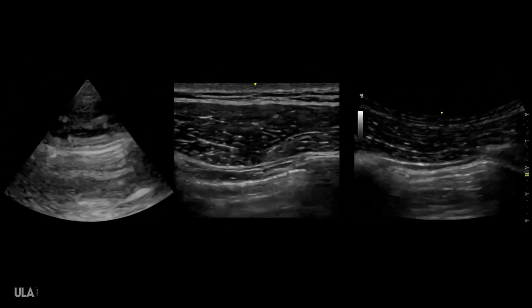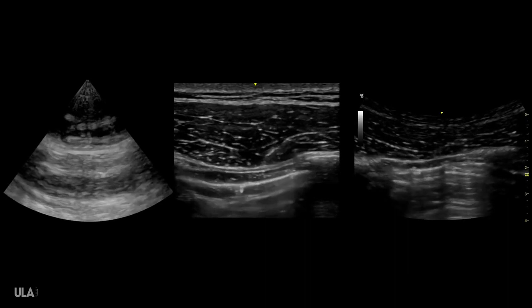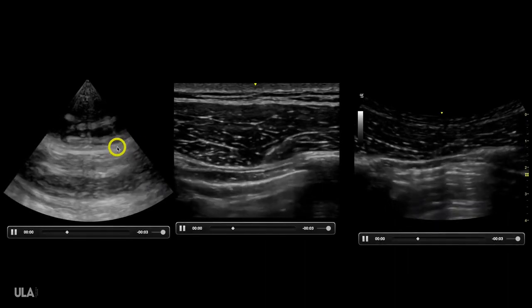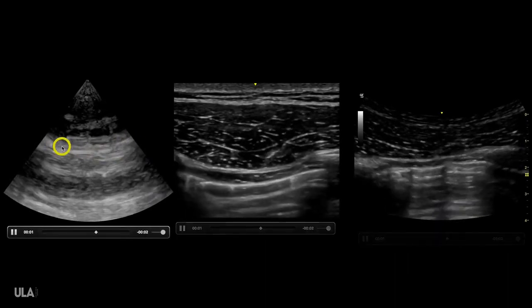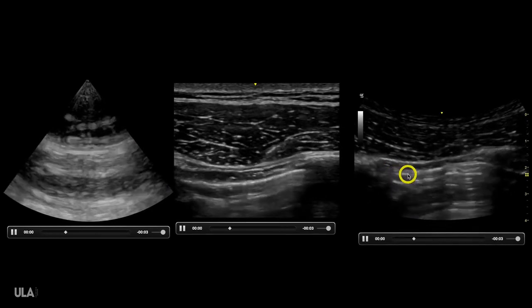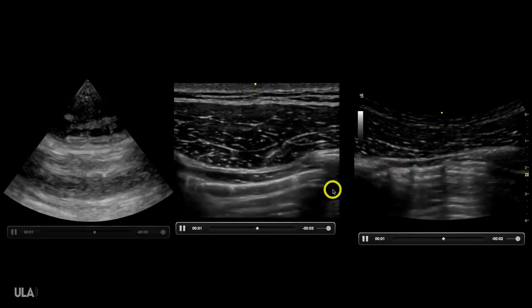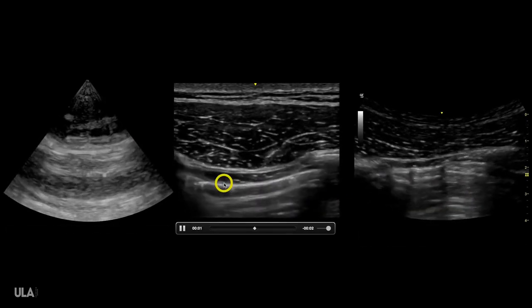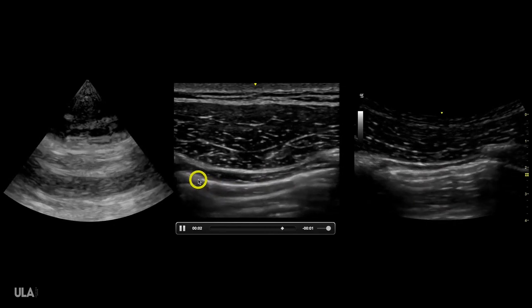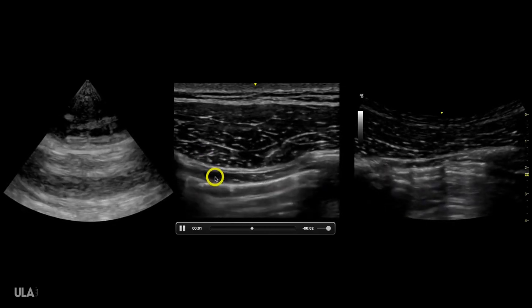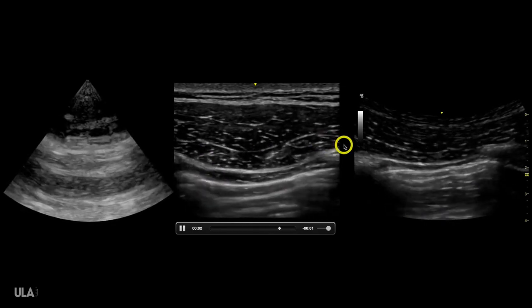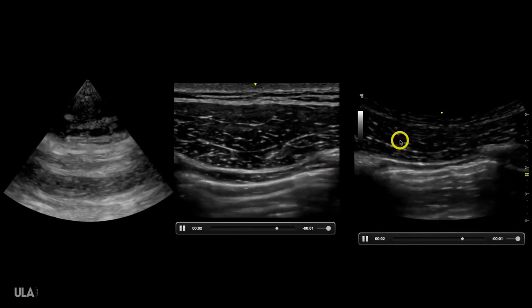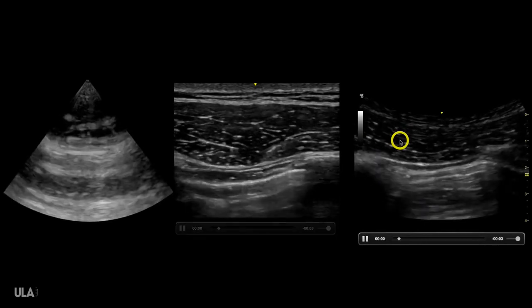Here is all three probes on the same patient. We have the phased array transducer — we can see sliding here. This is the curvilinear — we can see great sliding. And here is the linear transducer, which is honestly the best one to do it. We can see that especially between the linear and the curvilinear, there's not that big of a difference between the two. So you don't necessarily need to switch.